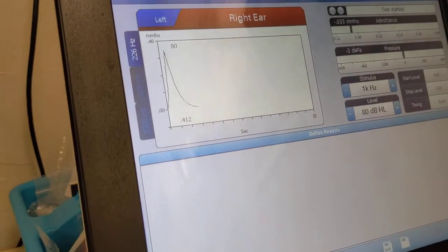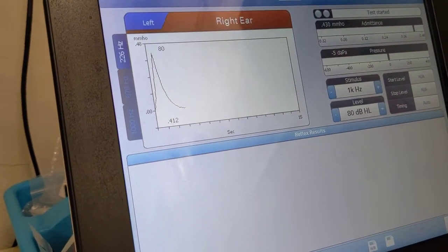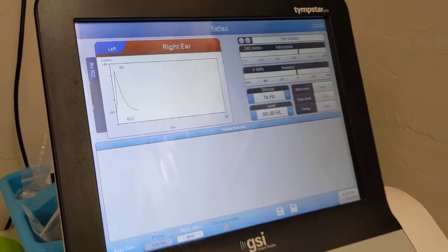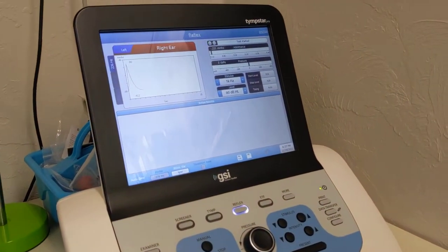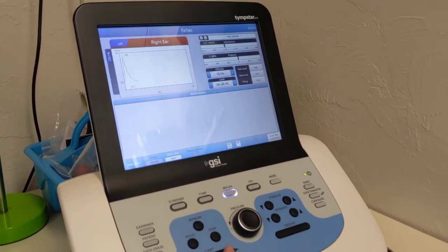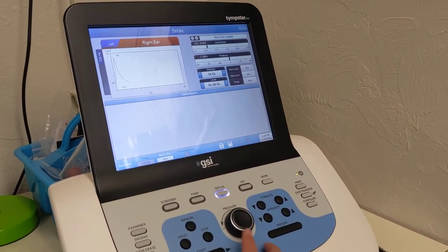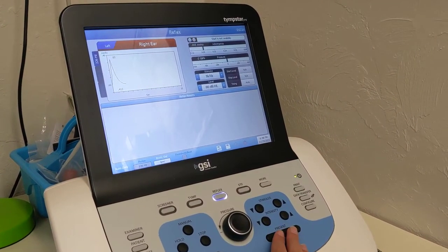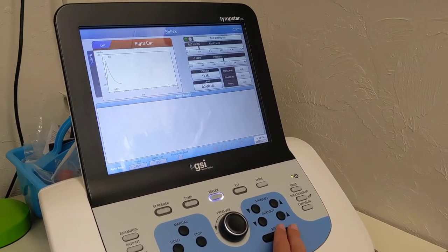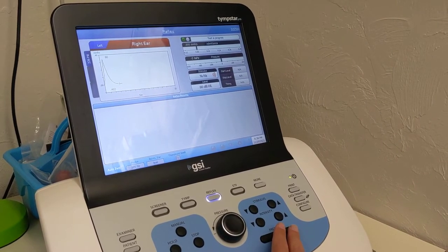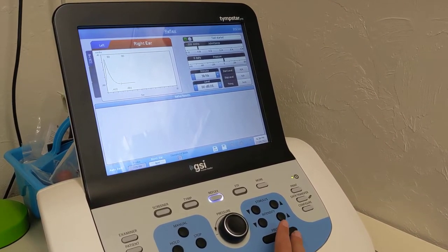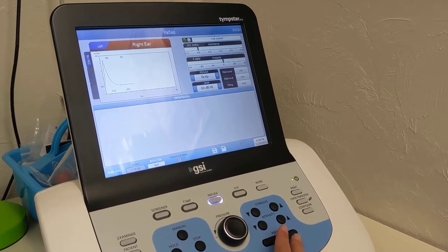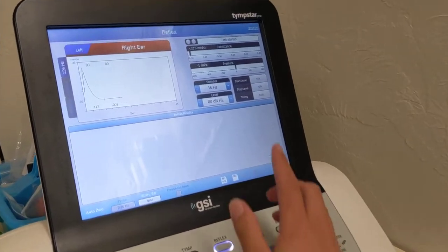Okay, so here you can see that because I was talking, got a little bit of artifact. So let's try again, I'll be quiet this time. Okay, great.